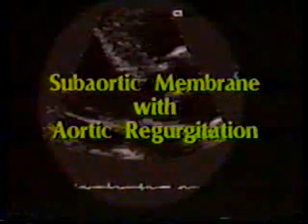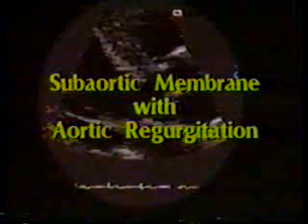Discrete subaortic stenosis can either be membranous or fibromuscular. This is the magnified long axis view of a 49-year-old patient with discrete subaortic membrane. Here is the aortic valve, and in this frozen frame you can clearly visualize the membrane in the subaortic position, resulting in left ventricular outflow tract obstruction. Visualize this in real time now.